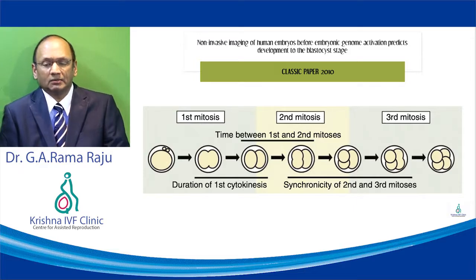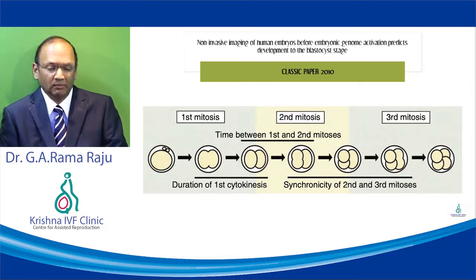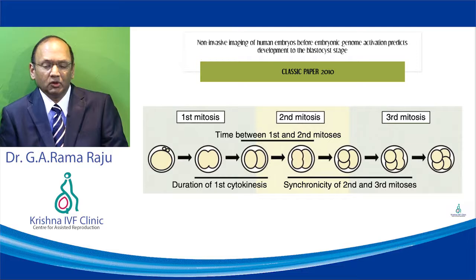Then you have a classic publication from 2010 by Wong, who did non-invasive imaging of human embryos before embryo genome activation to predict development to the blastocyst.